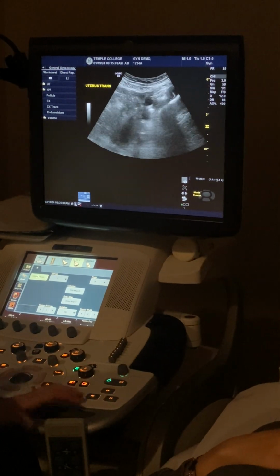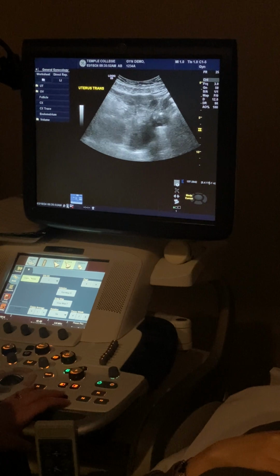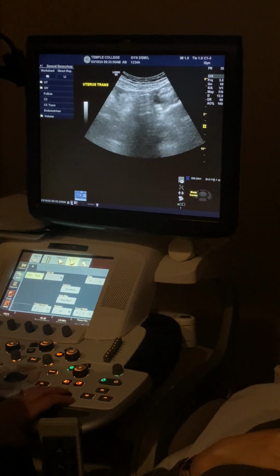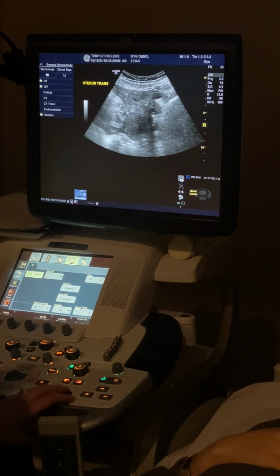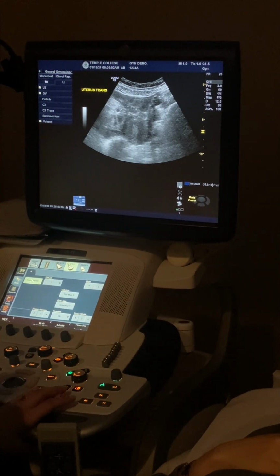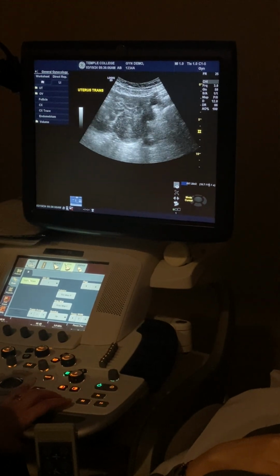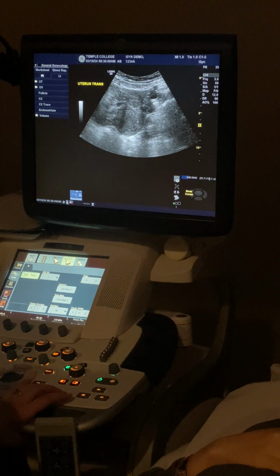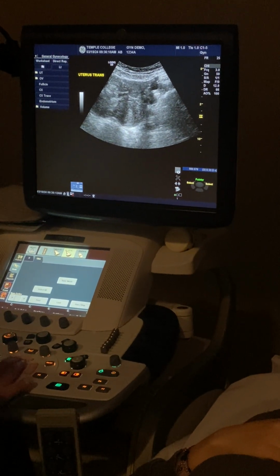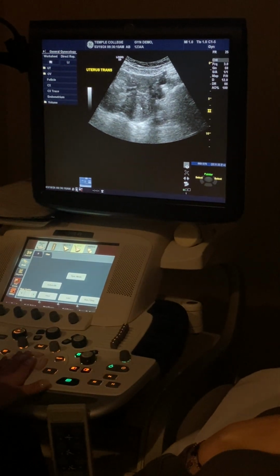If I go in trans, because she's retroverted, I don't know if this is going to work as well, but we'll try. When you're retroverted, getting transverse endo is a little bit hard because what you end up seeing is just where it splits at the cornua. You guys see what I'm talking about when I say, see how it splays out like that? Yeah. Okay, because that's coming from the tubes from the cornua.